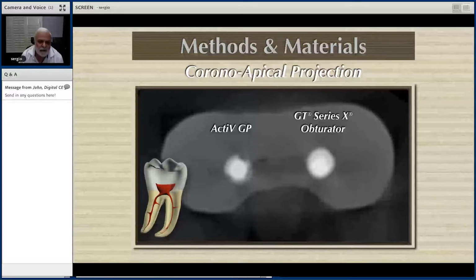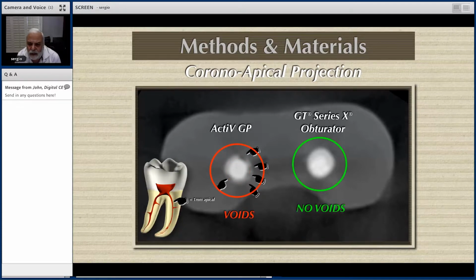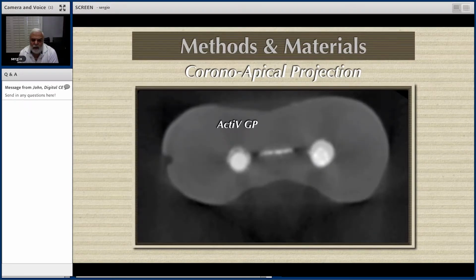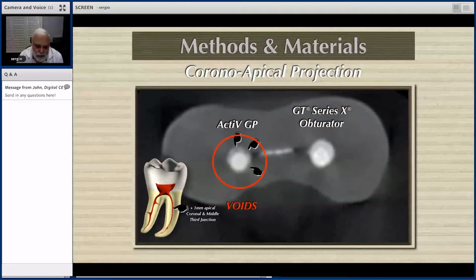Here again, you have the active GP. We are going down millimeters, which is full of voids. That's the single cone. And look, on the obturator, it's no voids whatsoever. Now, here will be the junction between middle and coronal. And look at the single cone, full of voids, no voids. Look at the core obturators, no voids there.